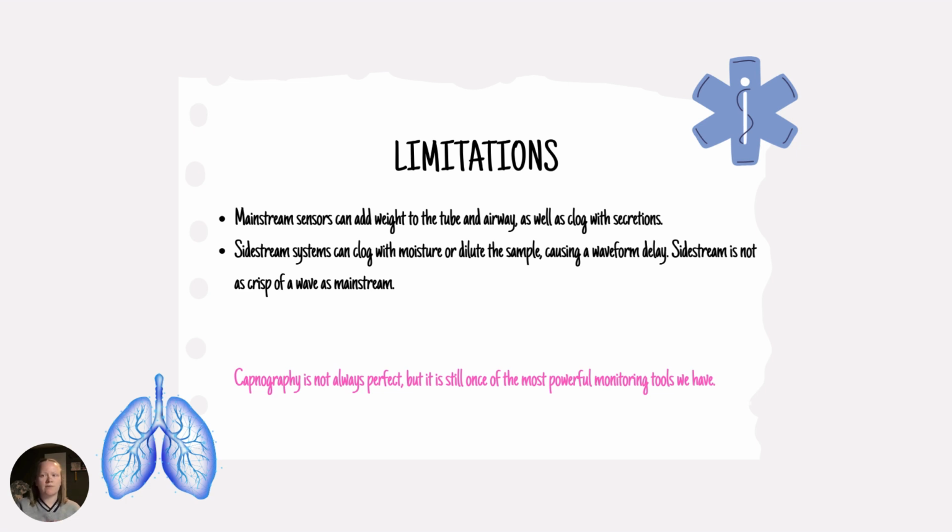Like all tools, capnography is not perfect. Our mainstream sensors can add weight to the tube, to the airway, and clog with secretions, and then our sidestream systems can also clog with moisture. It can dilute the sample, causing a waveform delay. And of course, it's not as crisp as a mainstream, though still a good tool. Capnography is obviously not perfect because nothing is, but it is one of the most powerful tools that we have.